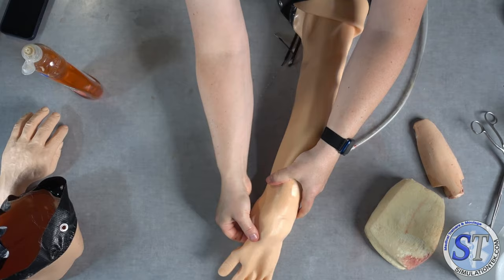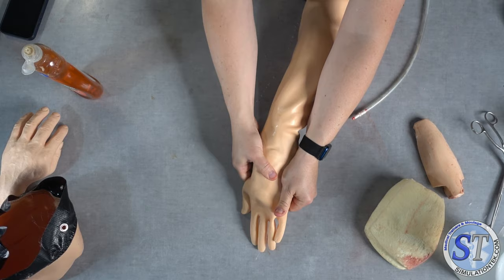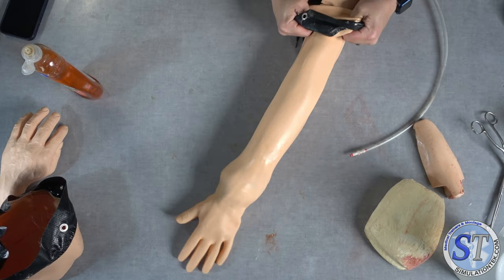So what I wanna do is, get it some of the way on, make sure I'm still oriented. So I've got my thumb here, I've got my thumb in there. And so then we're gonna kinda slip it on a little more. And we just wanna do this in little pieces, little parts.